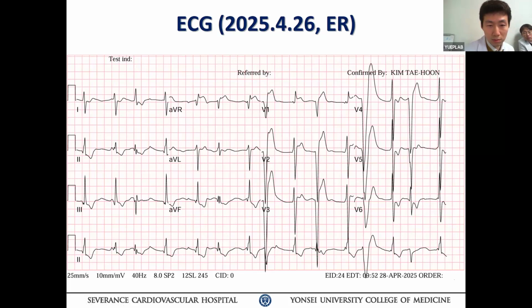We consider many different morphologies of QRS. The wide QRS complex looks similar to what we saw previously. PVC.